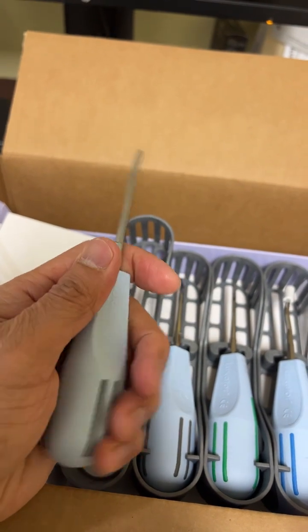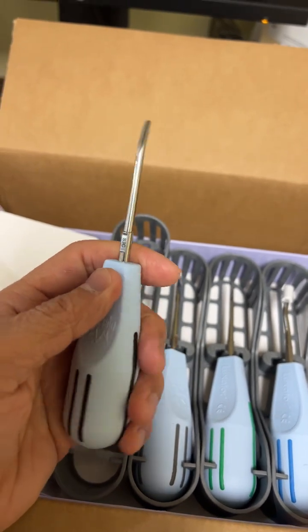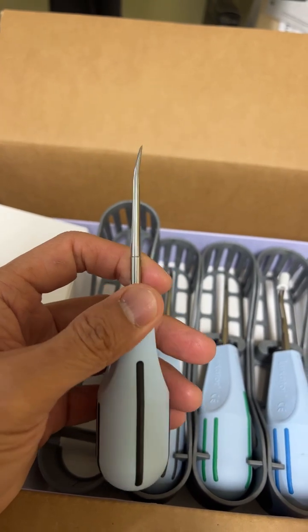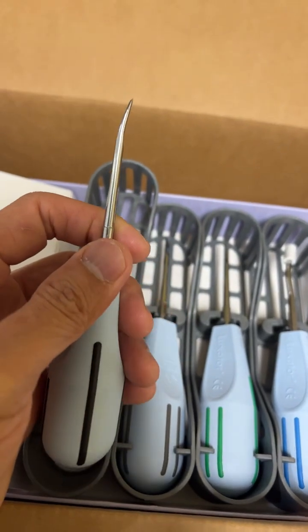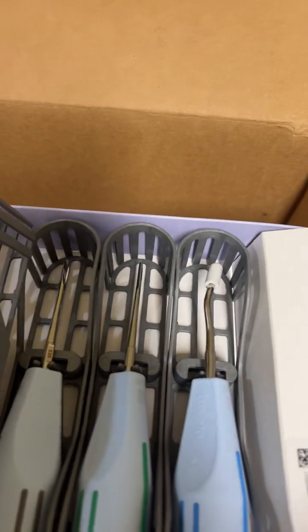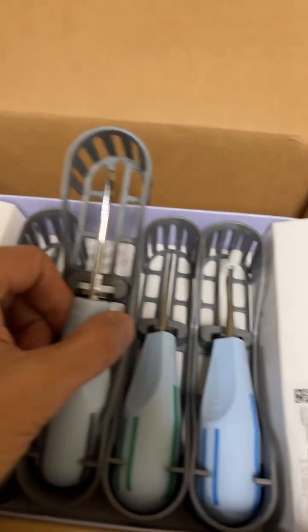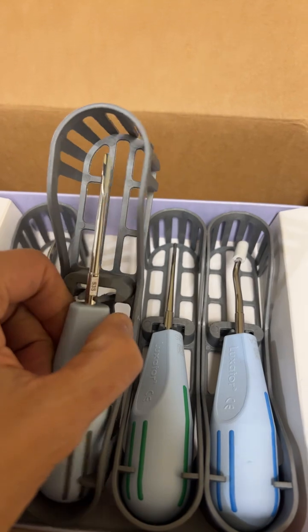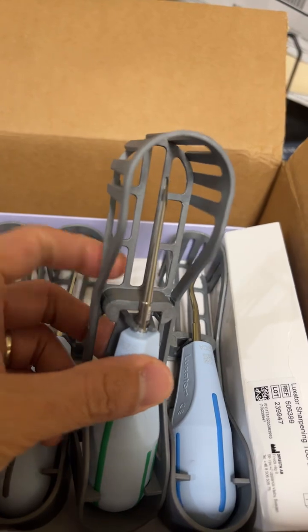The purpose of the luxator is basically to luxate the tooth so you can take it out without working too hard. What that means is you go under the socket of the tooth and loosen up the periodontal ligament to take out the tooth — that's what luxating means.